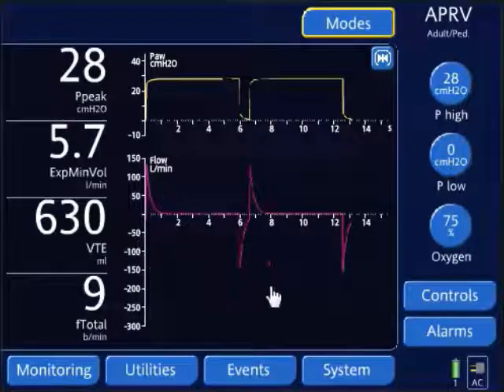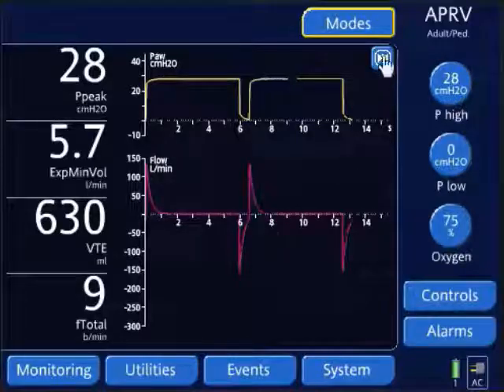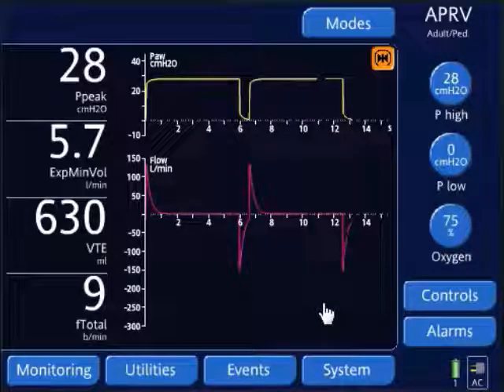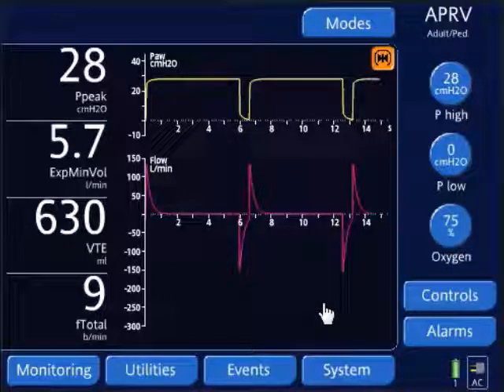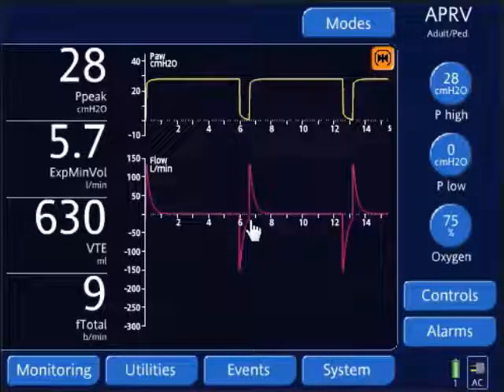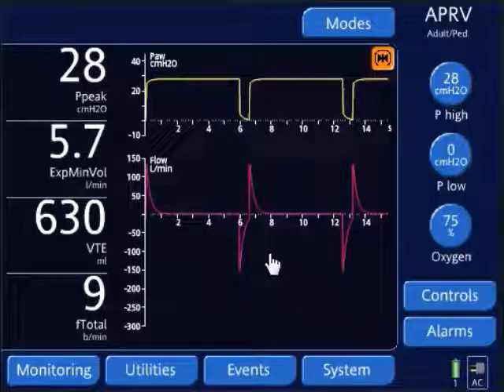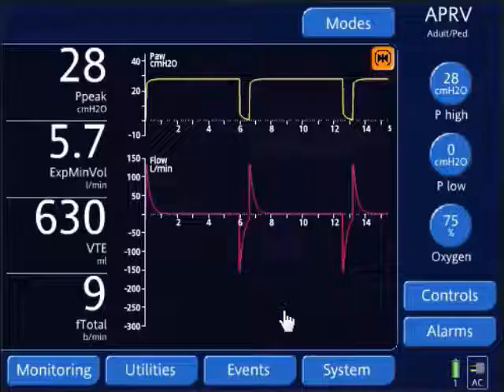Here's my flow waveform, and we want to look at the expiratory portion of it. I'm going to freeze the screen to take a closer look at the peak expiratory flow and the termination point. Here's my peak expiratory flow and here's my termination point. If it's below 50% of the measured peak expiratory flow — which it is — I want to decrease my T-low setting to bring the termination point up to 75% of the peak expiratory flow.